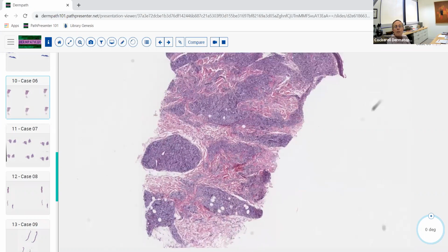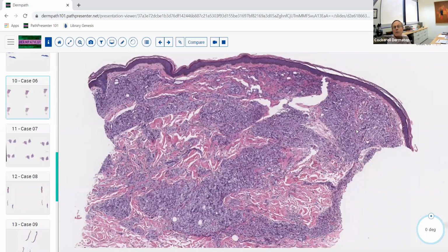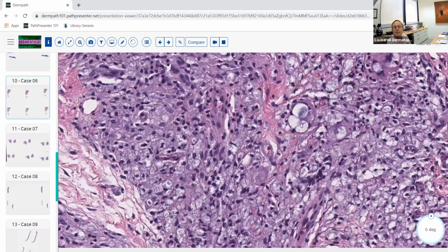So here we're looking at a lesion that would be more on the polar or borderline lepromatous pole. We've got a diffuse infiltrate of these histiocytes. Notice the grenz zone, so the epidermis is not involved very commonly in this. And you've got all of these very foamy histiocytes that contain these organisms in here.